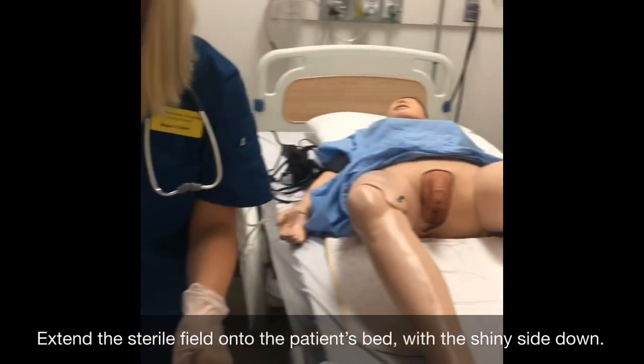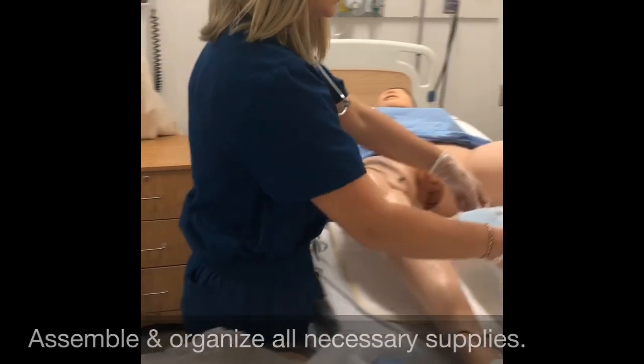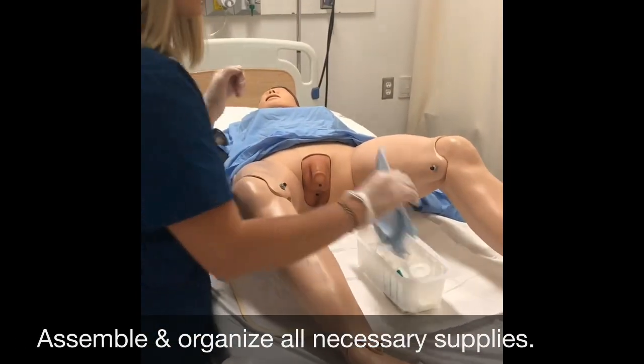Okay, and I'm going to grab my catheter kit and place it in between the legs of the patient. I'm going to grab the fenestrated drape.